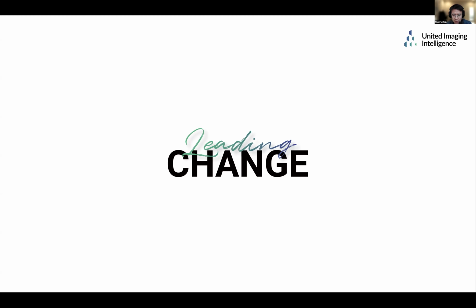Okay, we separate it into two parts. For the static one, we evaluate based on the very traditional method. We use PSNR and SSIM metrics to quantitatively evaluate our reconstruction method compared to the fully sampled data, which we treat as the ground truth.